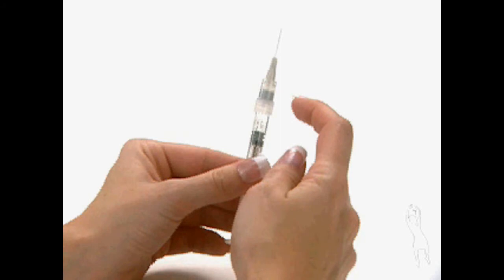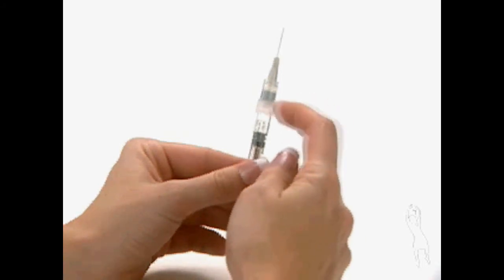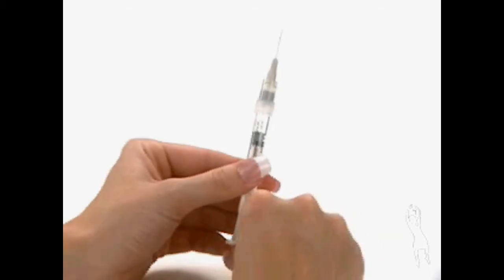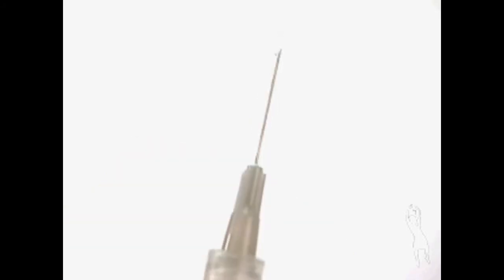Remove any bubbles from the syringe by pointing the needle up and tapping on it. Push the plunger carefully until a small drop of liquid begins to appear from the tip of the needle.